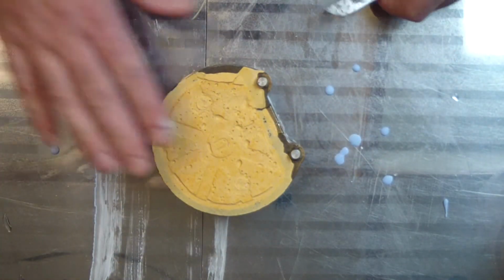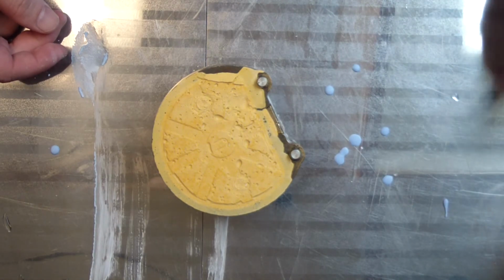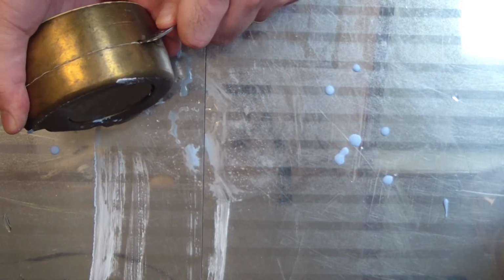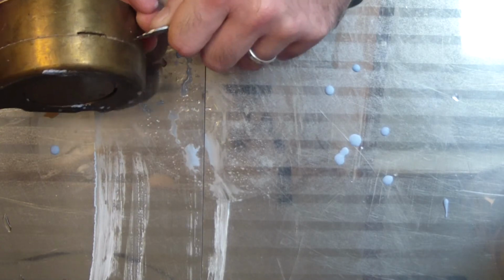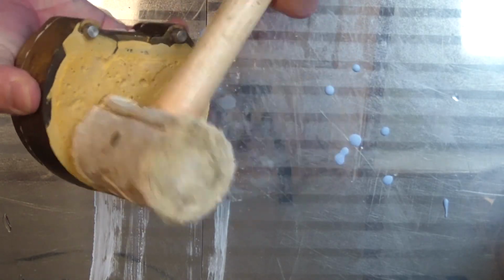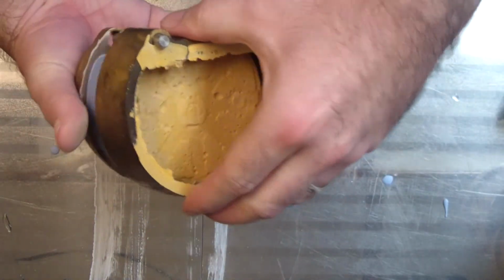So I'm just going to pop my cover off. On this case I just used the flow flask. I didn't have enough of the flask stone. I only had a sample of flask stone to use on the entire case, but the flow flask I did use. Pry that up a little bit. I'll grab my rawhide hammer. So that should come right off.